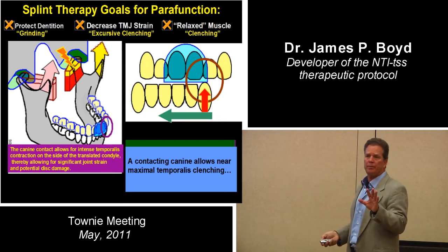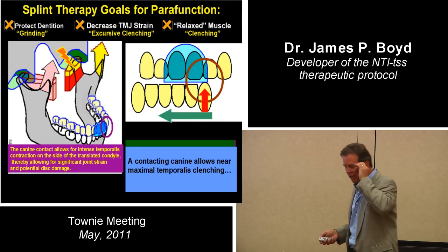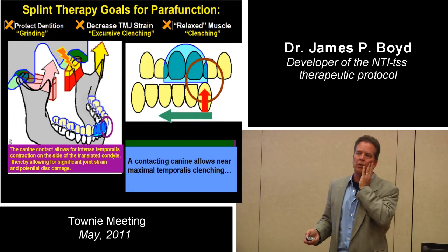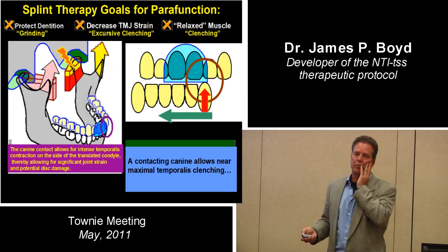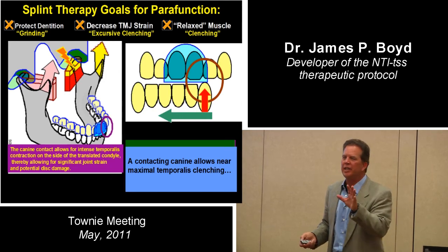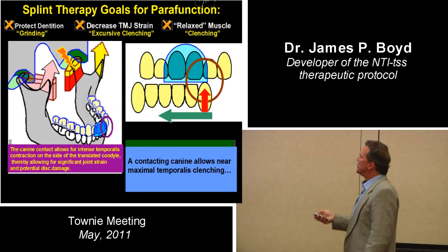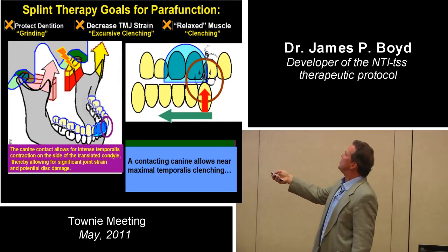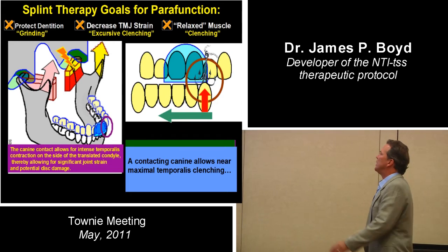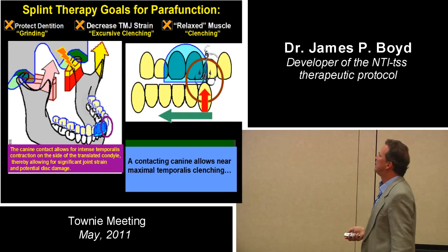It's not comfortable. It happens after 2 or 3 days, so you'll hear some lecturers say, well, you can use a jig, but only temporarily, only for a night or two. Why not the 4th, 5th, 6th night? Because pretty soon the patient takes it out and goes, ha, found it. Usually takes a couple nights, sometimes right away. So now you've got this new anchor, this new contact for the temporalis to run hot. So you see they go, oh, geez, I need to modify the deprogrammer.